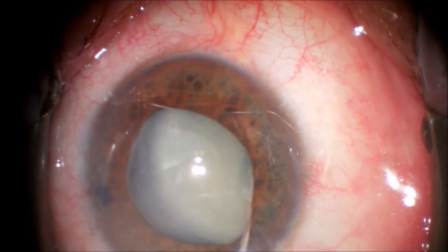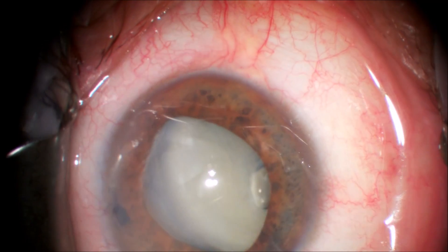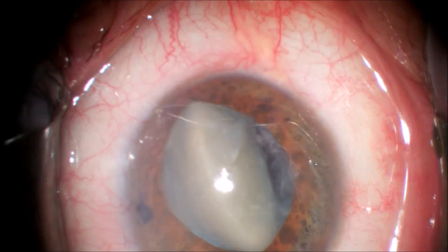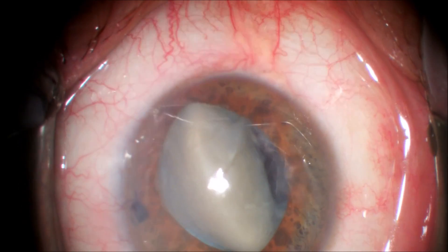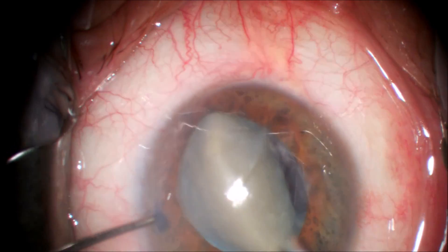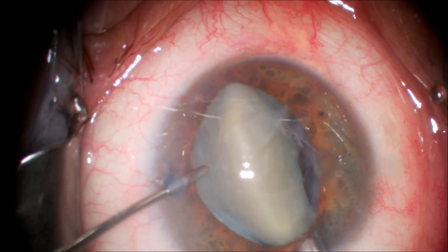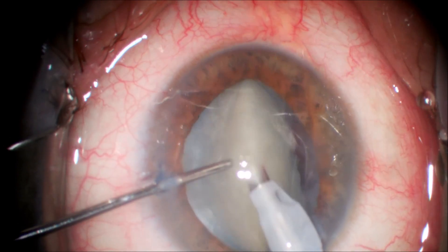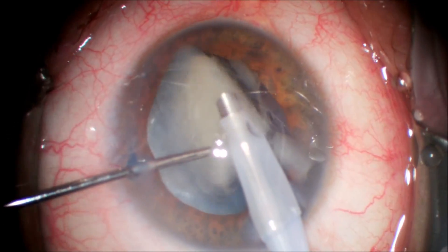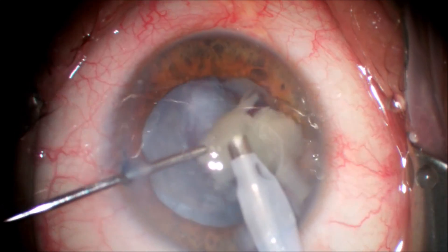We proceed with hydrodissection done gently to see if we can free up the nuclear contents. Injecting balanced salt solution underneath the anterior capsule shows that the lens is prolapsing anteriorly. At this point I decide to proceed with a supracapsular removal of the lens nucleus. We've turned it to a vertical orientation and will carousel the nucleus into our phacoemulsification handpiece using a second instrument and a high vacuum setting. The nucleus has been suspended vertically with viscoelastic on the superior and inferior sides and is rotating onto the phacoemulsification tip, being removed very quickly in this supracapsular cataract removal.